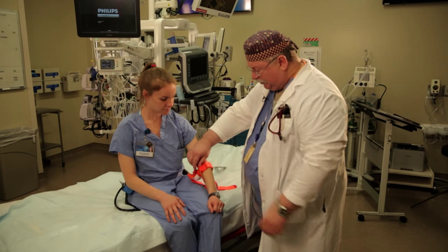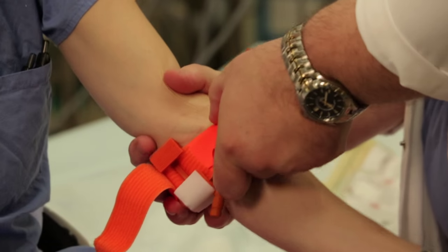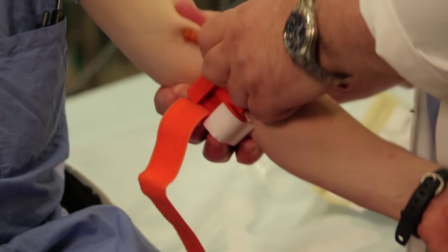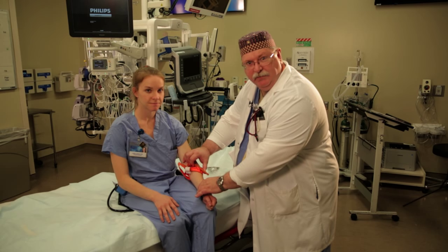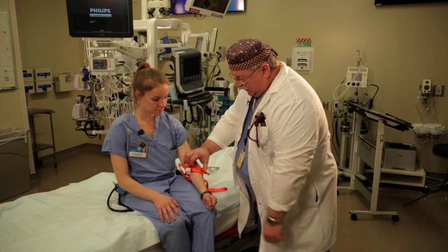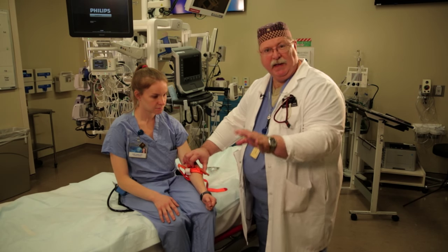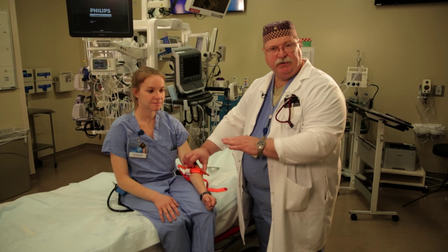And then, just like the old Boy Scout windlass and cravat, we're going to turn this windlass until the bleeding stops and we feel that there's no pulse distal to that tourniquet. And then we'll secure this in place and monitor this wound to make sure that as the patient improves and the blood pressure goes up that she doesn't start to re-bleed.